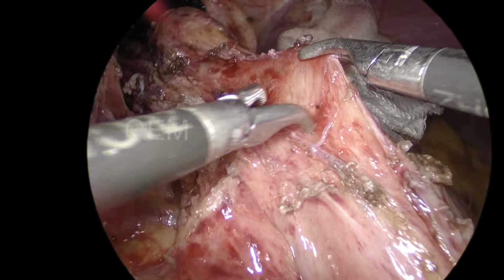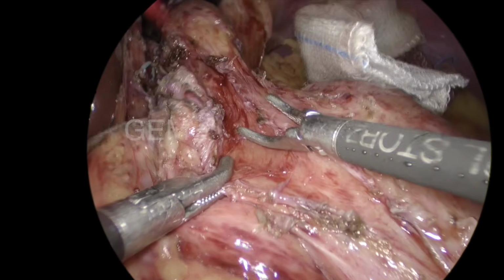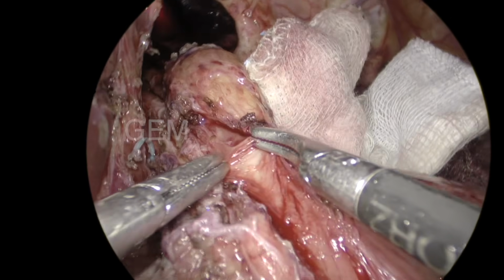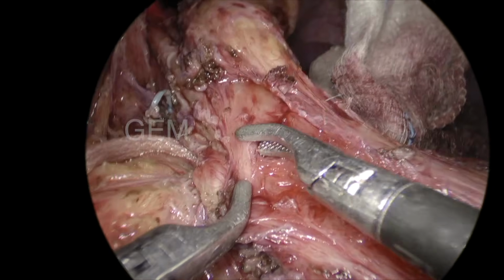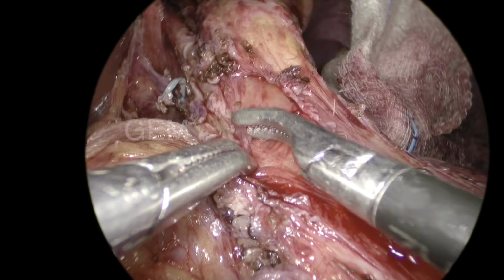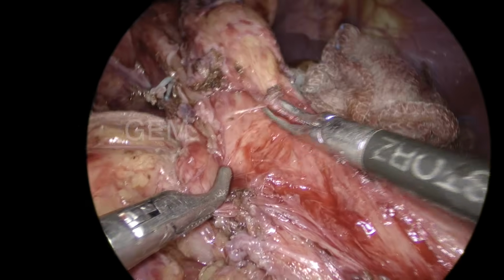So I decided, okay, I have not done the myotomy fully. I just removed only one layer. Still the muscle layer is there. So now I started doing a myotomy. You can see the muscle. Previously it looked like mucosa, smooth mucosa. So now I started doing the myotomy.